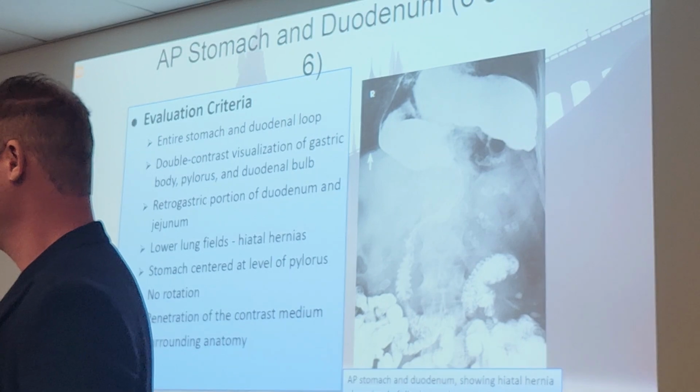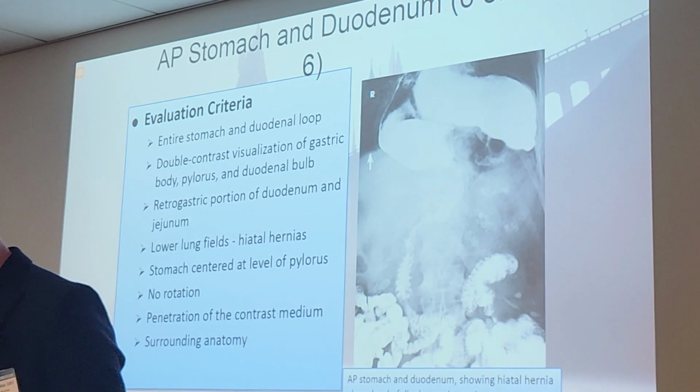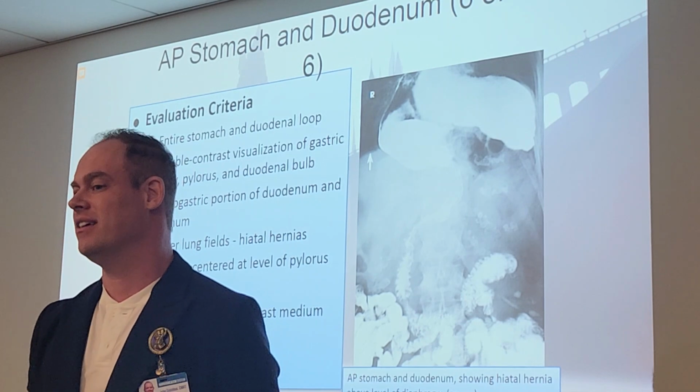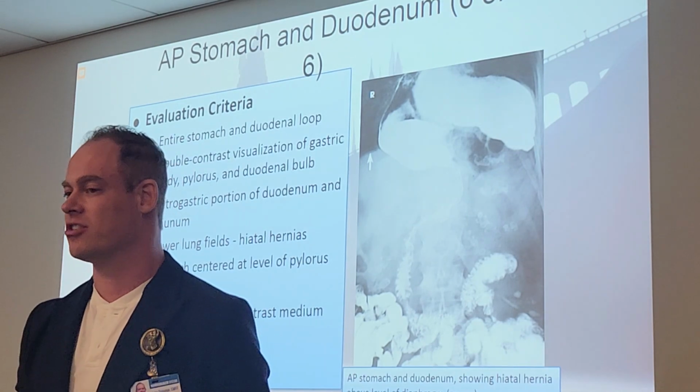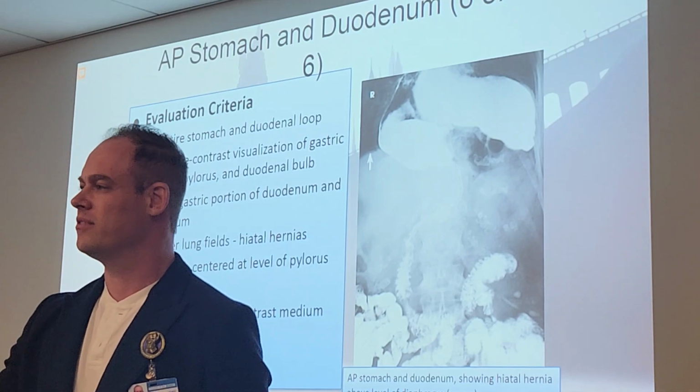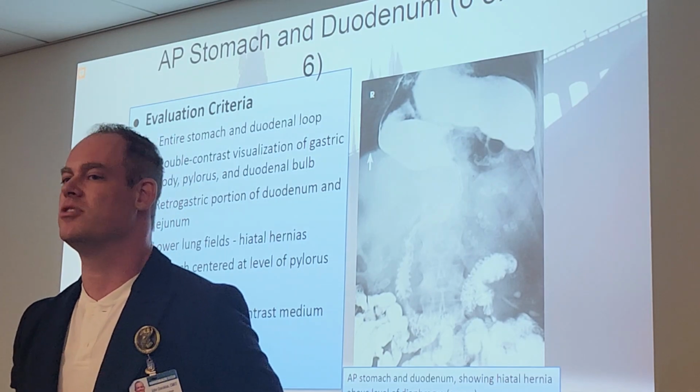LPO and AP supine. The barium's in the fundus, the air's in the body. Therefore, the other 3 projections are going to be the opposite. So if you know those 2, apply the opposite principle to the other 3 projections.